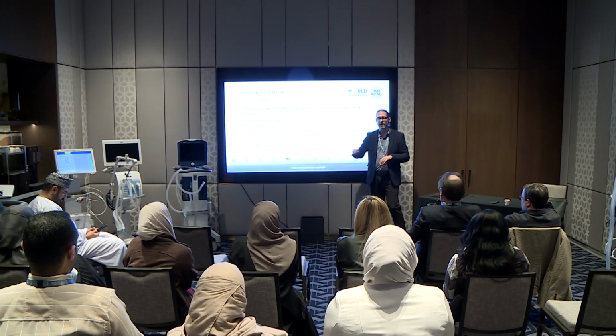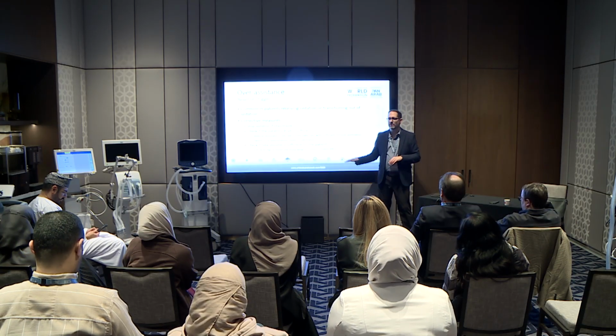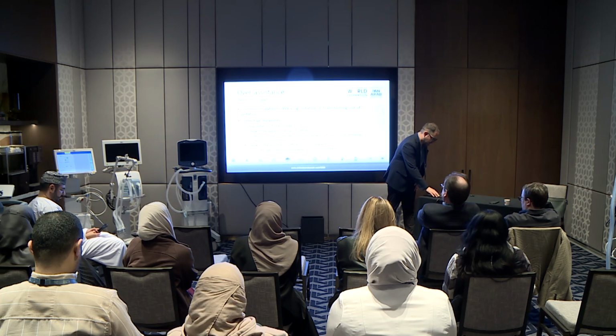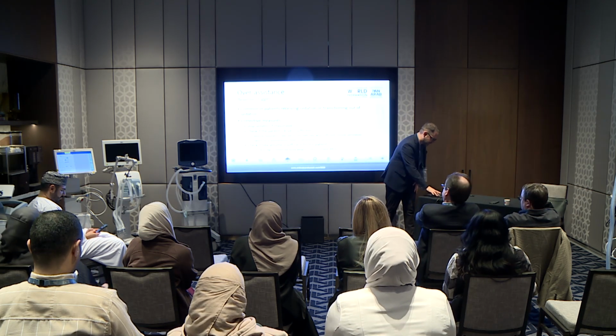Some patients will respond to an increase in tidal volume and they'll stop the reverse triggering. But if it's not safe to do so, I wouldn't recommend increasing volume in someone with ARDS, for example. 8 is okay, but I wouldn't go up to 10 or something like that in someone who's way sick.